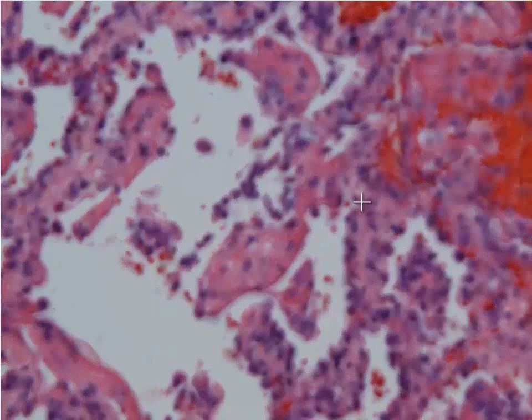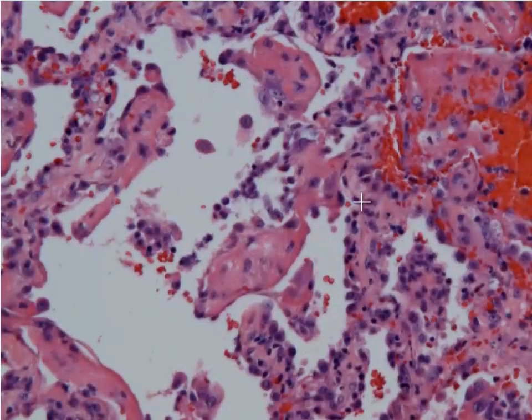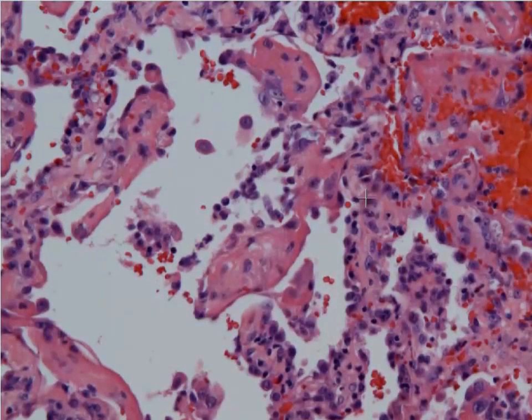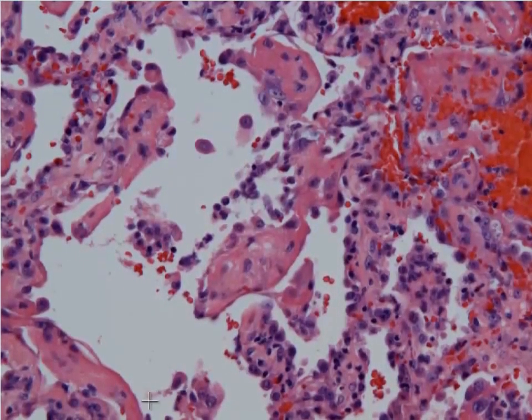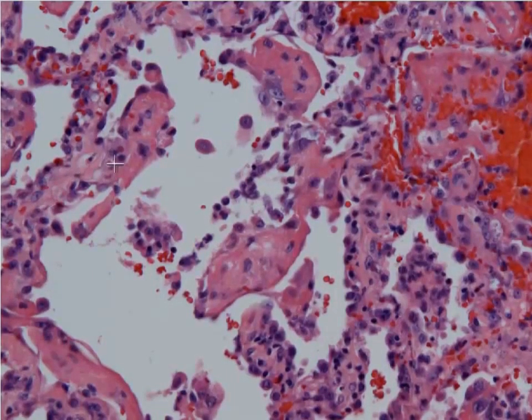This is a case of diffuse alveolar damage or acute lung injury, seen early on in the course, leading to hyaline membrane formation within the alveolar walls.